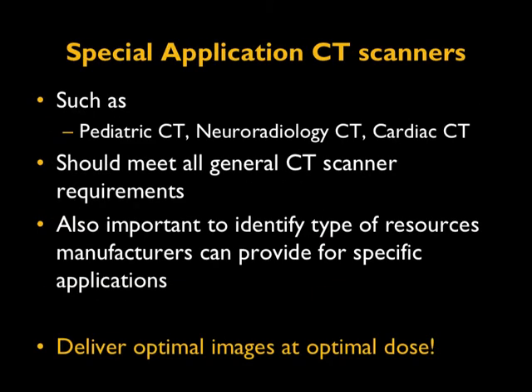What about the special application CT scanner? These are usually for clinics doing high-end research or wanting to be at the edge of the CT scanning field. For example, special application CT scanners can be pediatric CT, neuroradiology CT, or purely cardiac CT.